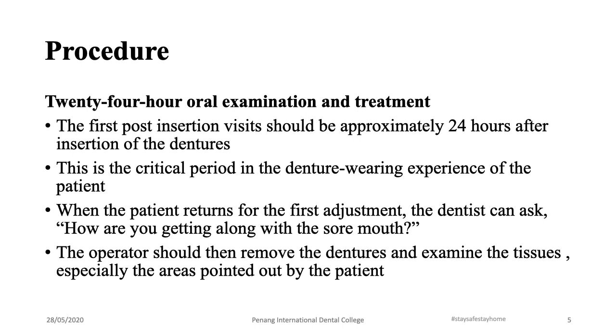So first thing, when is the patient recalled? The patient is usually recalled approximately after 24 hours. It can be between 1 to 3 days after your denture is delivered. So it's always good that you do it after 24 hours, but in case sometimes the patient does not come back to your appointment or needs a different appointment, it's better you do it within the 3 days.